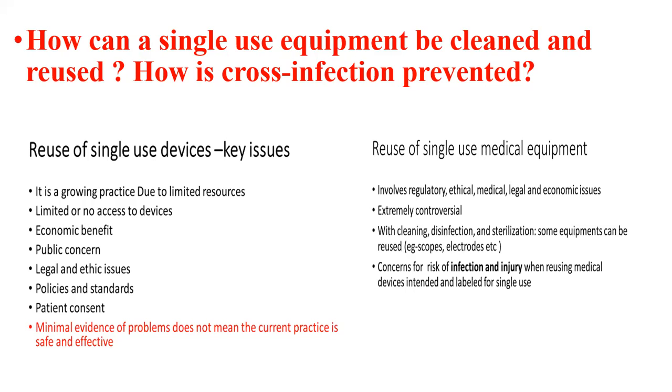but saying that you can reuse doesn't say it is safe. If you want to reuse it, take care of it, clean it, and then reuse it, because rather than having zero, you can have a reusable device around you. And take into consideration ethical and legal issues, patient consent, and also policies and standards of your facility. For reusable equipment, take care of their safety. Next, please.